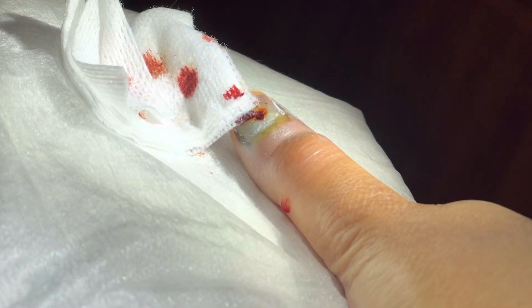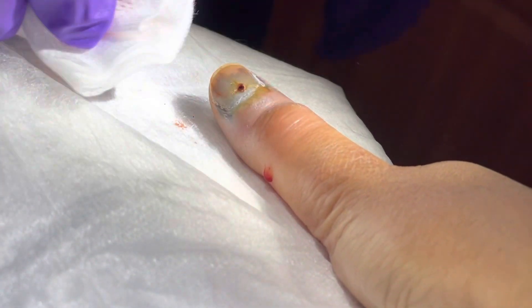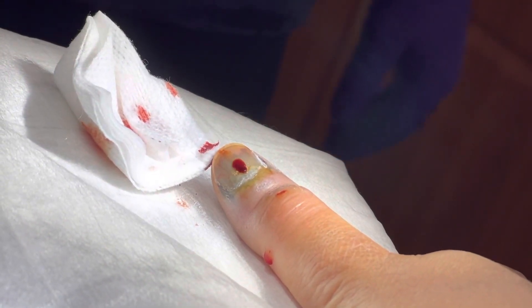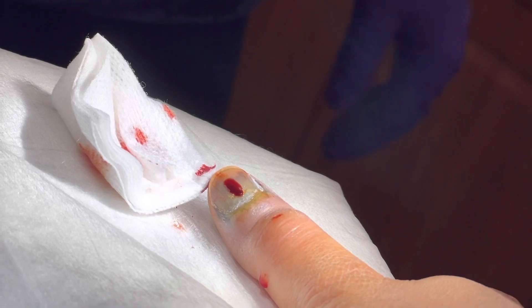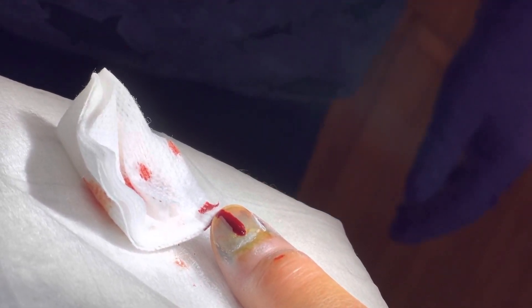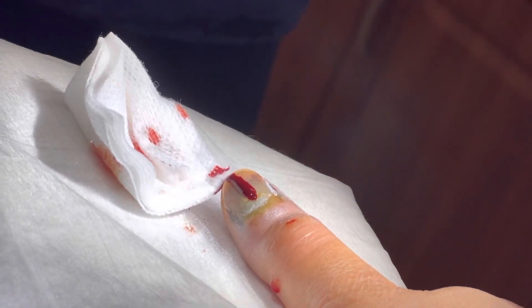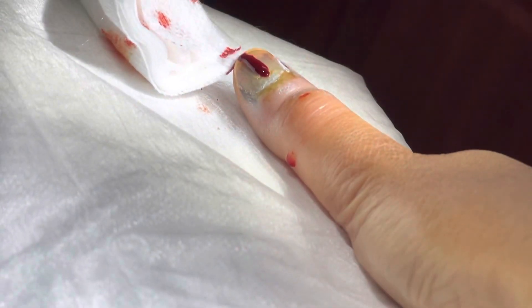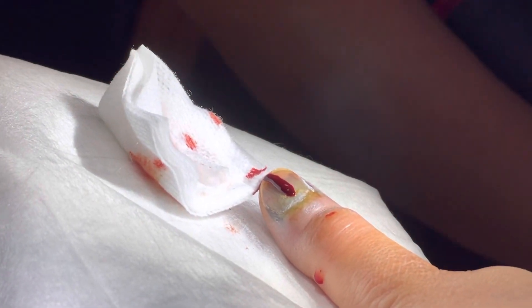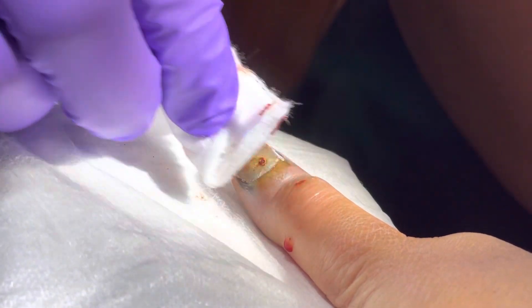Does it just keep oozing out and that's how the pressure comes out? Yeah, it'll ooze and kind of decompress itself. Usually you would think that the blood would be congealed, like dried out. But I'm not sure what sort of anticoagulant keeps it still liquified in there.